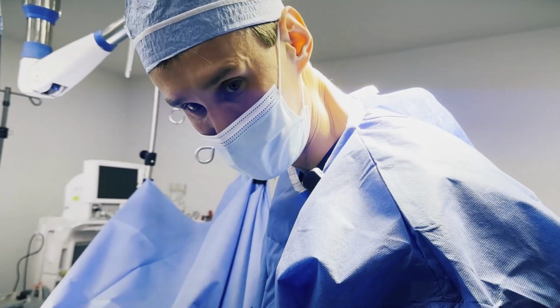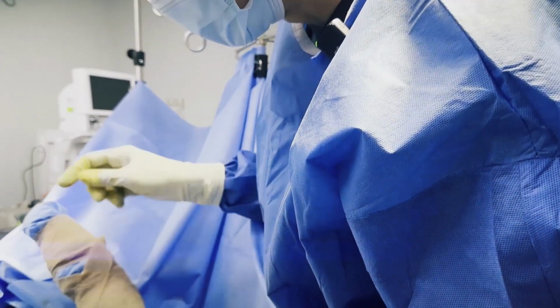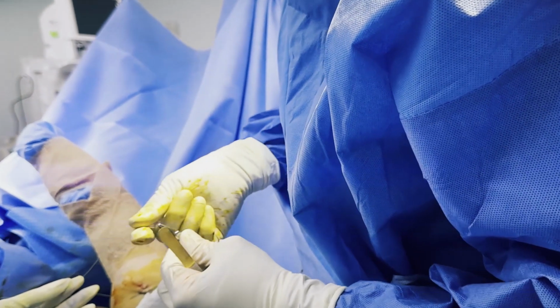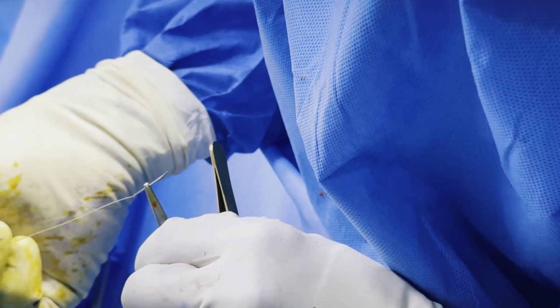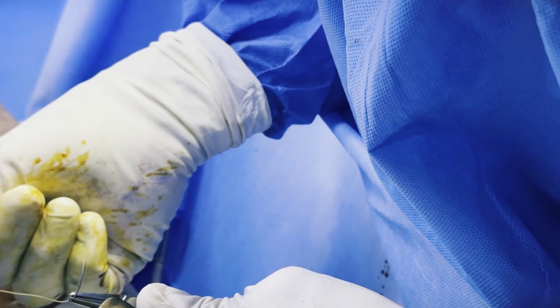For our skin closure, we utilized a special suture with little hooks, little barbs. It zips the incision and distributes the tension more evenly, helps to form a better scar, and also speeds up the closure process.